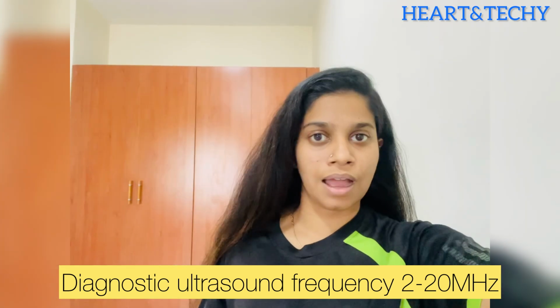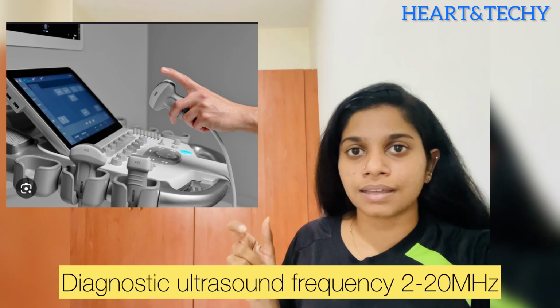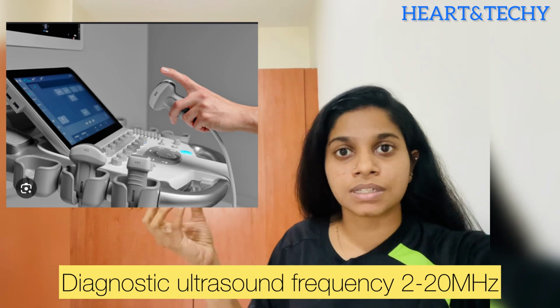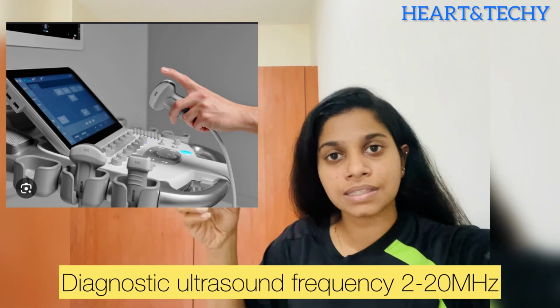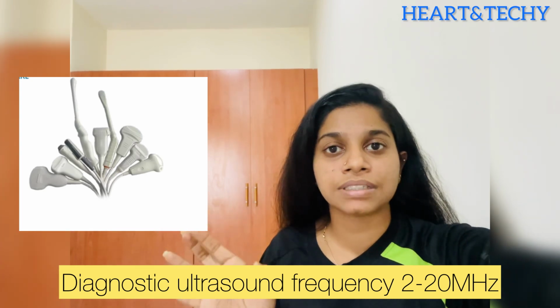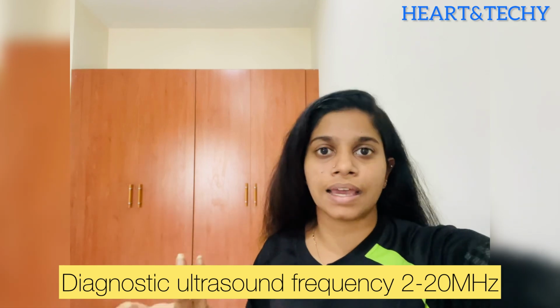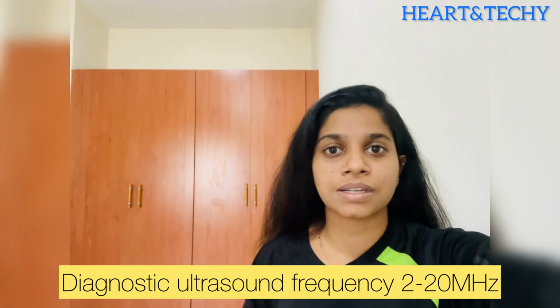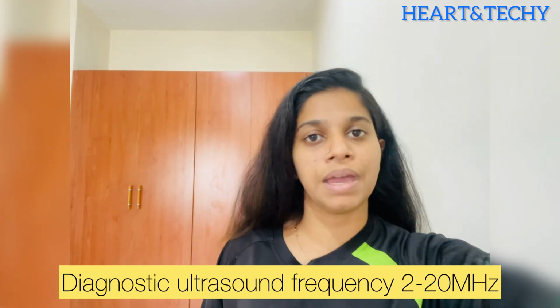In an ultrasound machine there are different probes, which we use for scanning, and from these the ultrasound is produced. They have a frequency of 2 to 20 megahertz. We cannot hear the ultrasound when it is passing, and that is the reason behind it.